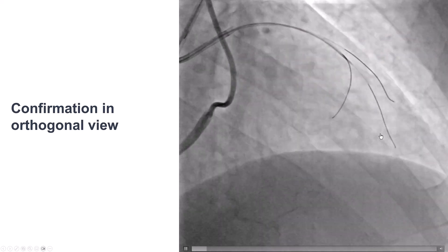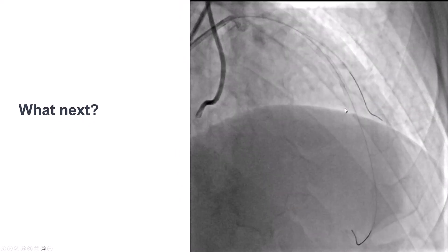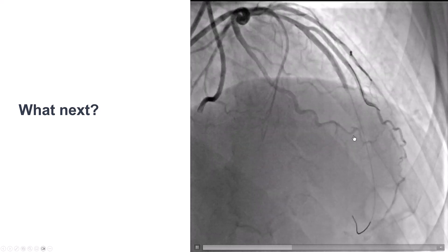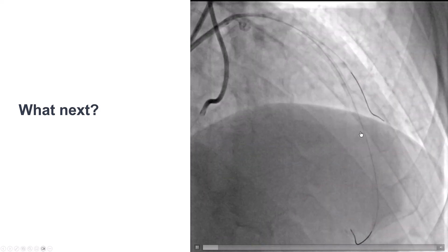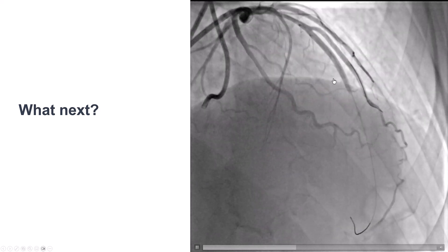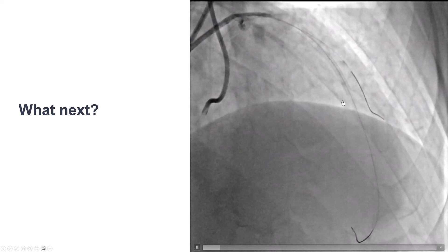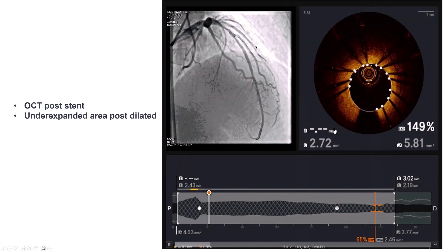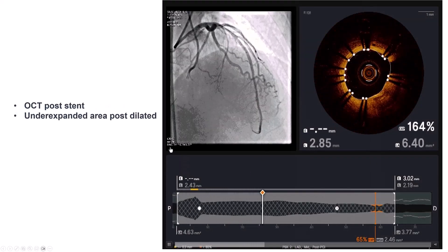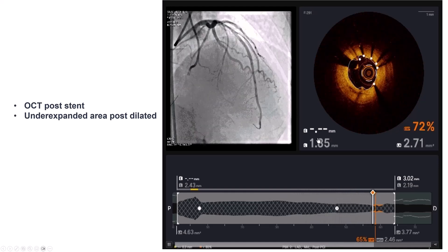Successful crossing of the LAD CTO. We predilated and stented, but then we had a problem — there was not much antegrade flow, which was fairly concerning since we were confident we were in the distal true lumen. Looks like the distal vessel may have had a dissection, so we placed an additional short stent, and then we did have good flow.